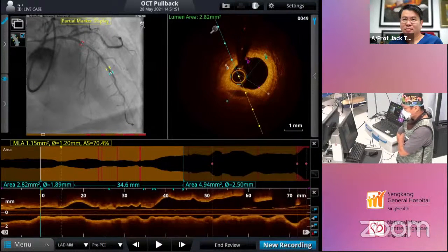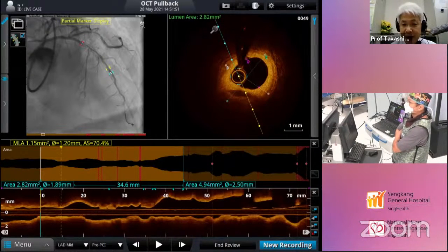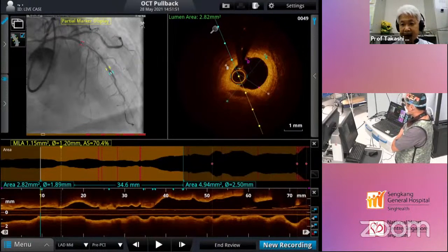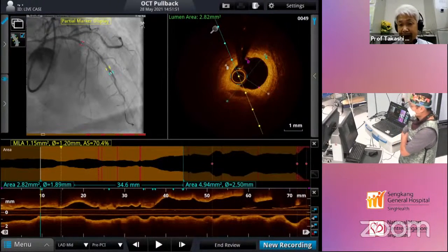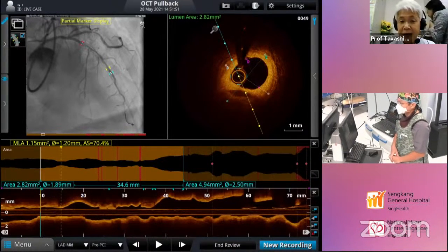Yeah, it is very important, I think. If the iFR is high enough, we can believe it. But in this case, we have to expect some distal embolization. At that time, some hyperemia may occur, and the iFR may be low, but it depends on the case. If the iFR is low, we cannot believe the value, right? We have to do FFR at that time. Therefore, iFR is very convenient, I agree, but there are some tricks. So we have to pay attention to the number.